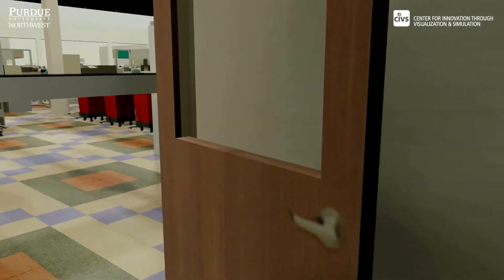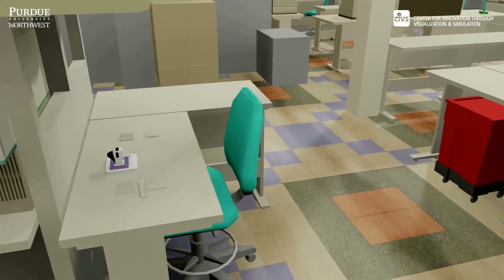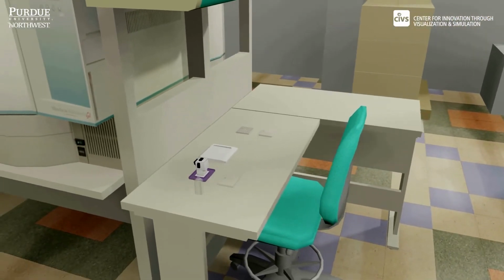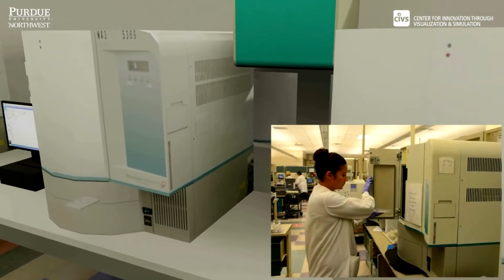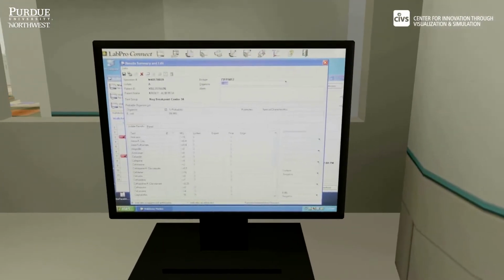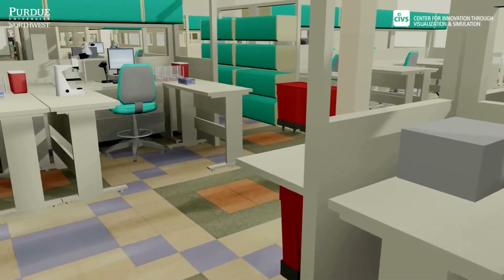The Prompt bottle is taken to a workstation to transfer it into a 96 well panel containing 26 different antibiotics. This panel is placed in the MicroScan instrument that incubates it for 18 hours. Each well is checked for growth of the bacteria to determine which antibiotics killed the bacteria and which ones were not effective. The results of the culture go through a final evaluation by a technologist before they are released electronically to the physician.